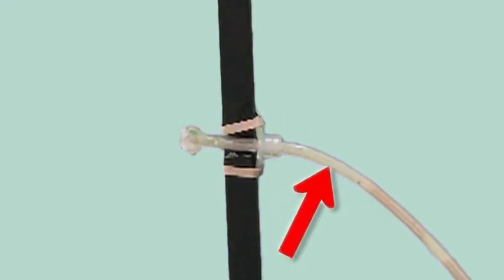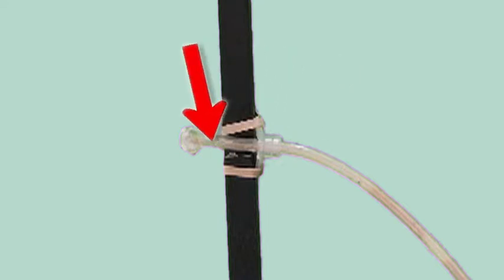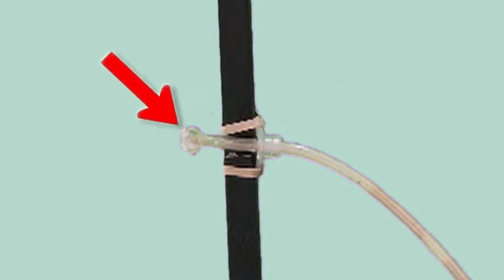The black board represents your abdominal wall. This is the outside, this is the inside. The tube goes through the abdominal wall right here, and there's a bolster keeping it up against the abdominal wall here on the exterior, and inside the abdominal wall is a little balloon keeping it from sliding back out.